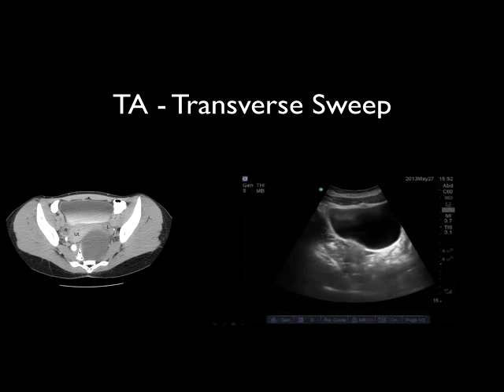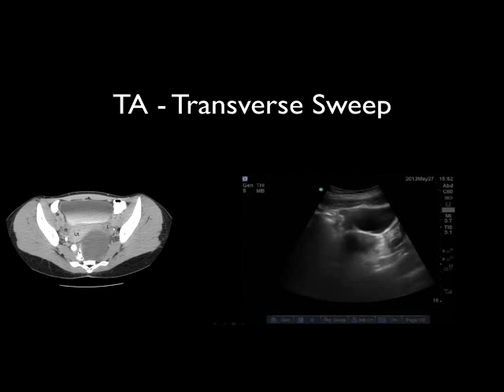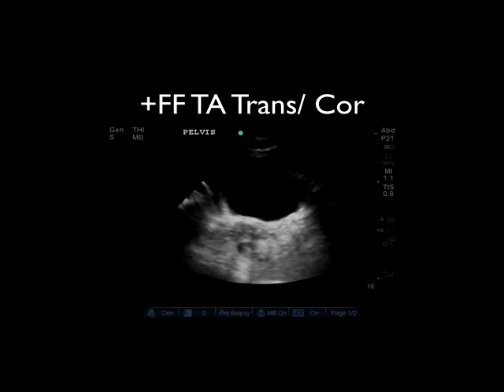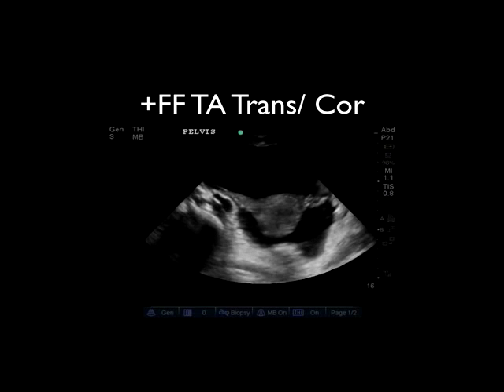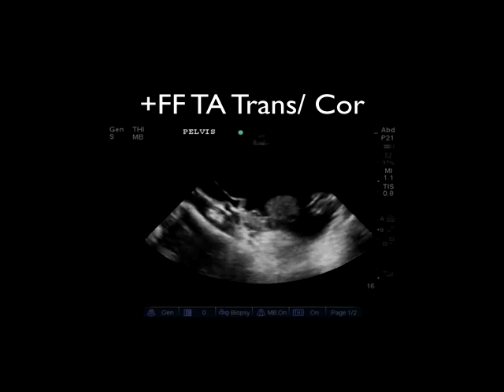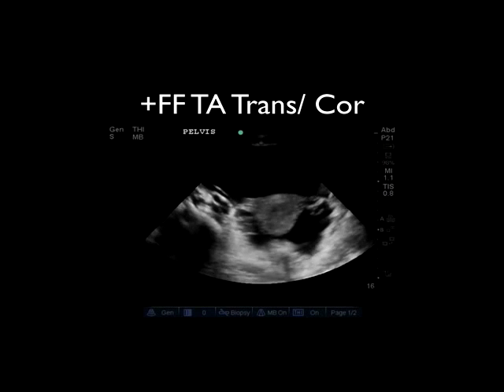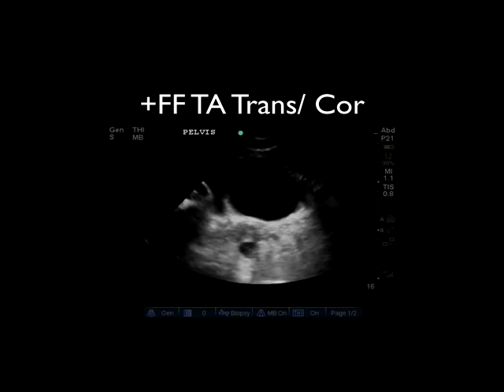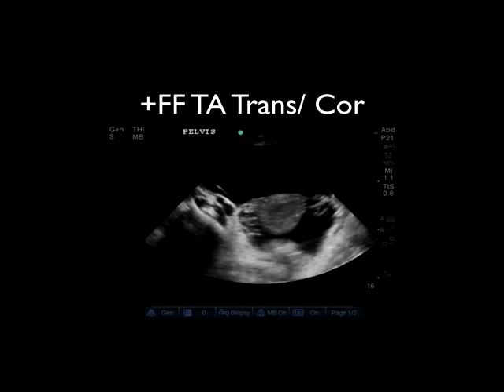This video clip starts with an image of the vaginal canal and then sweeps posterior to the uterus. Here's an appearance of the bladder, the uterus, and free fluid just posterior to the uterus. When looking at this image, try to identify which way is anterior, which way is the patient's right, and also try to describe how this is different from the normal images we've seen previously.